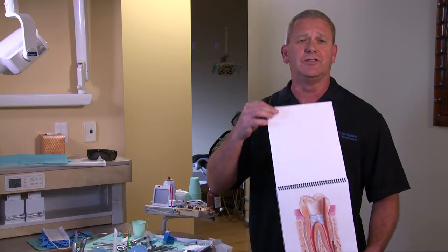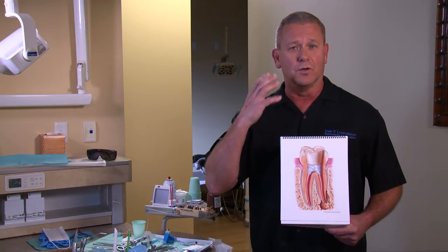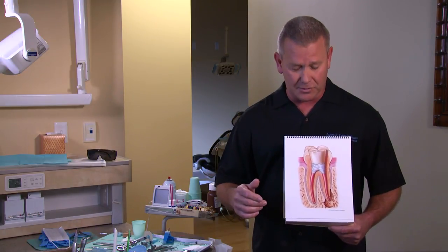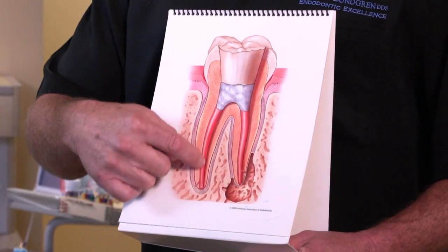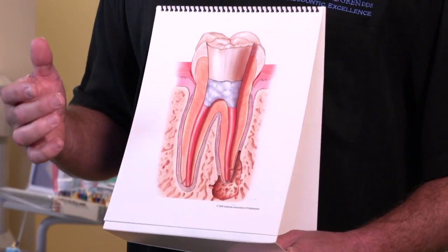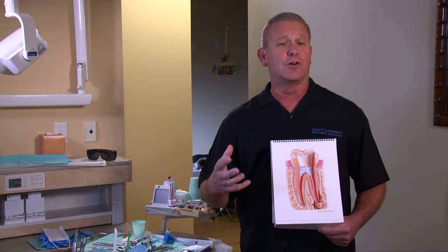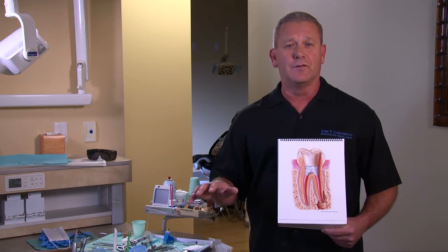Now, this whole procedure, once you're numb, takes about 45 minutes for a molar tooth, shorter for any other tooth. But when we take the final x-ray, you'll see white lines down the tooth, and that's your root canal filling. So now if you had hot or cold sensitivity as your chief complaint, that will be gone forever in this tooth because we've removed the pulp tissue.